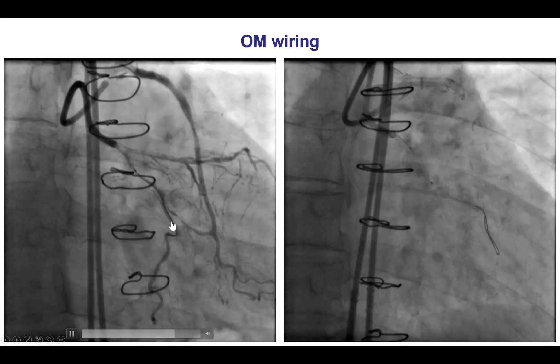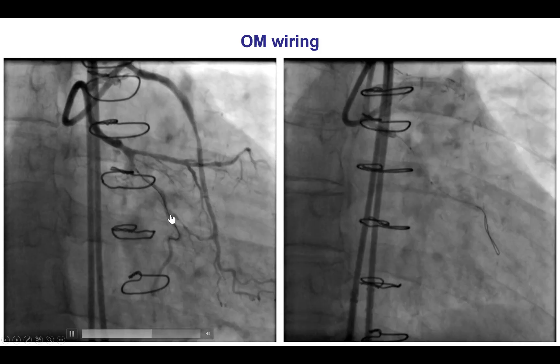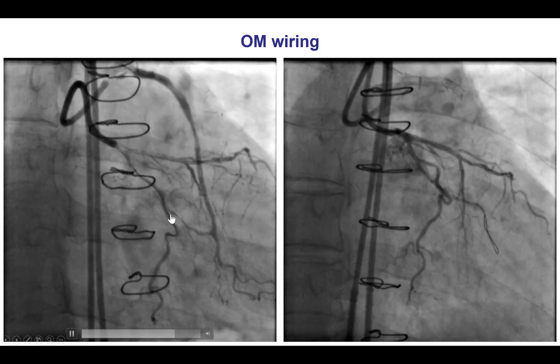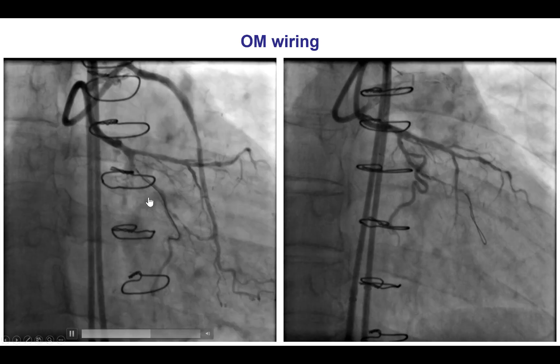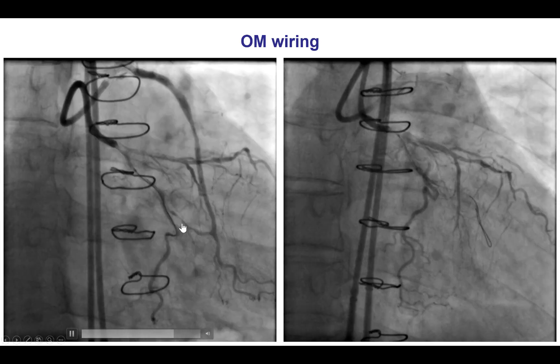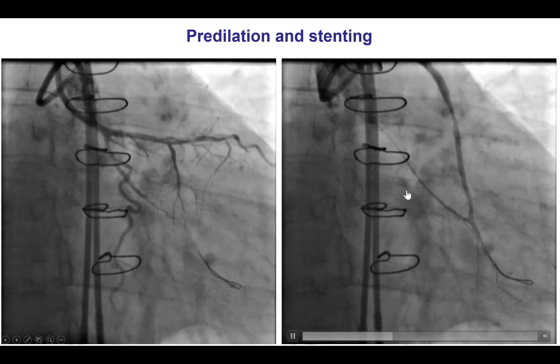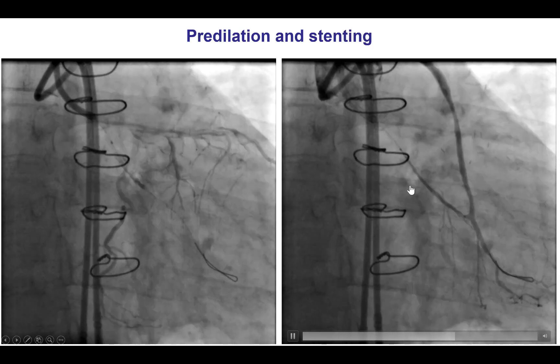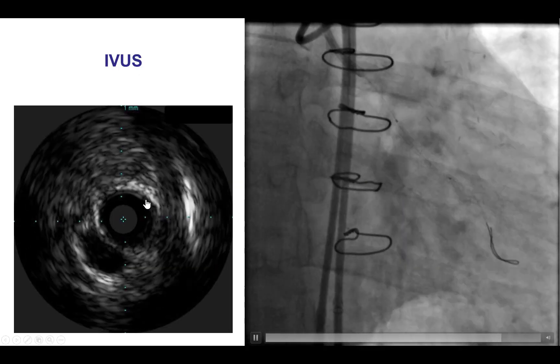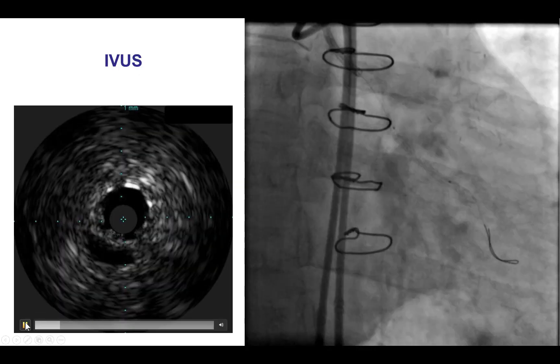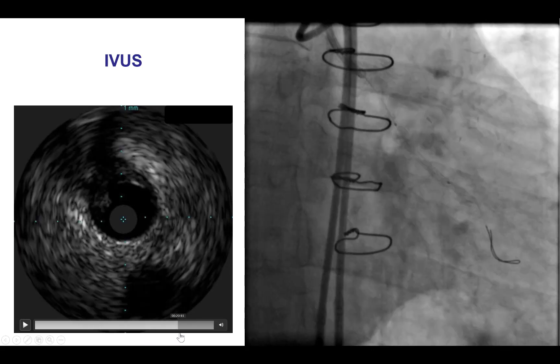This is an example where this initially appeared to be a CTO of the obtuse marginal branch. However, with dual injection, this is not a CTO but actually a non-occlusive lesion that was easily wired with a workhorse guide wire. We did a pre-dilation, placed a stent, and performed IVUS to check for expansion — and there was good stent expansion throughout that segment.